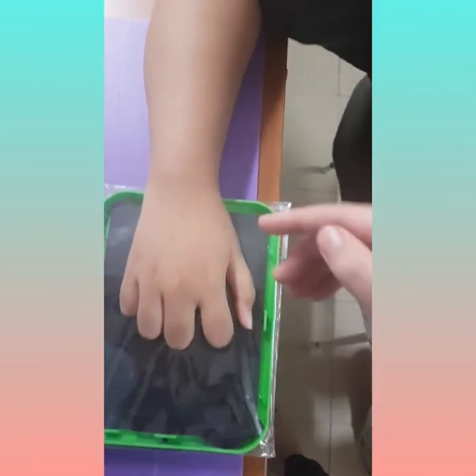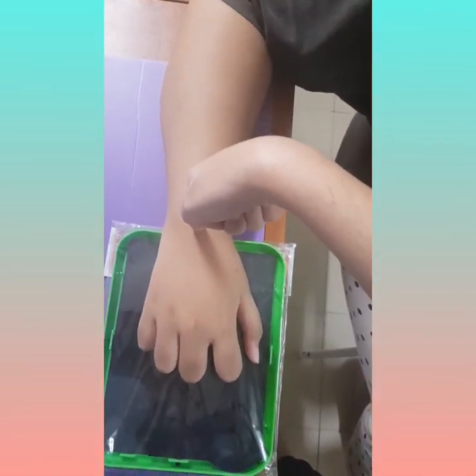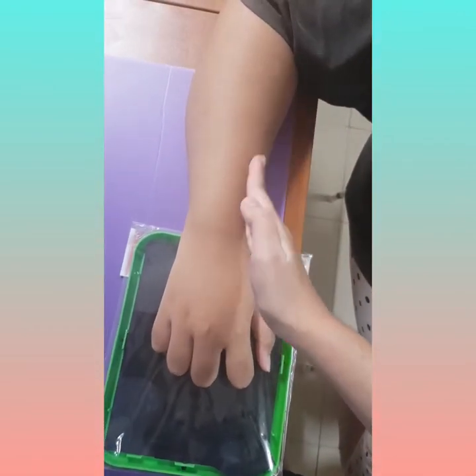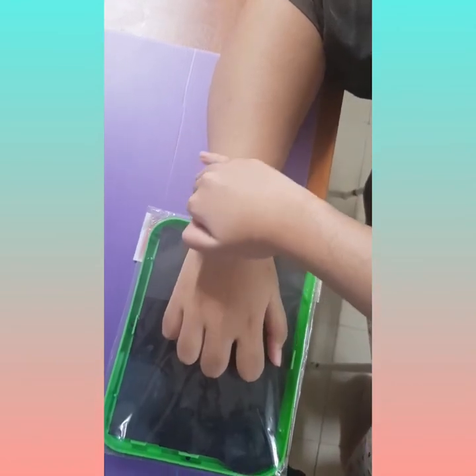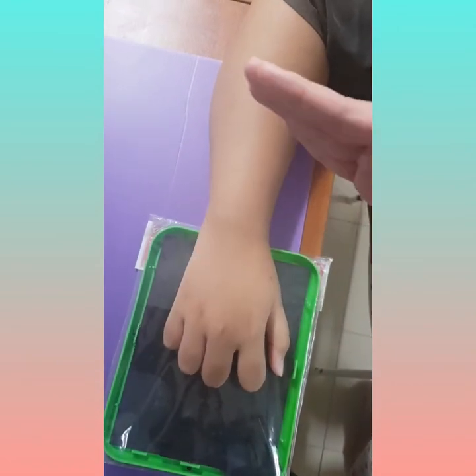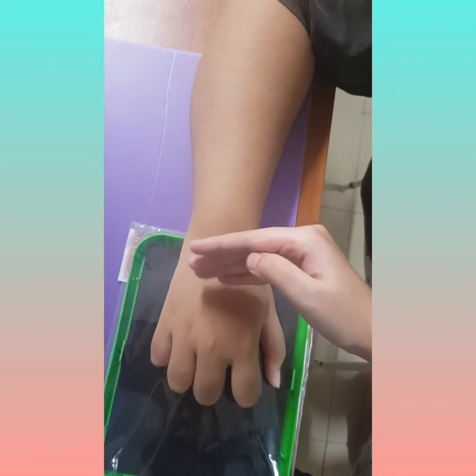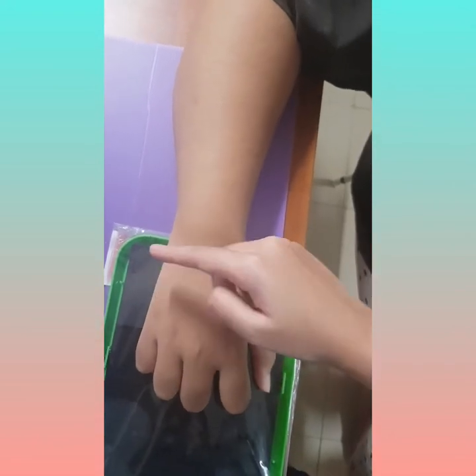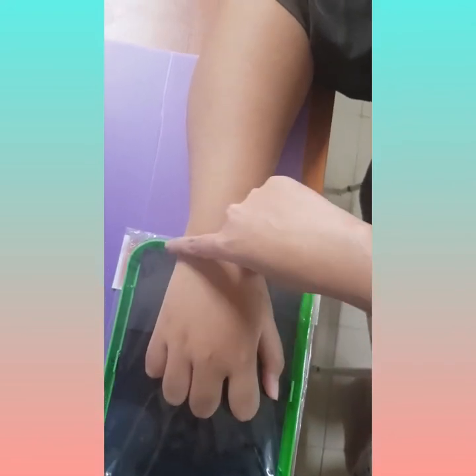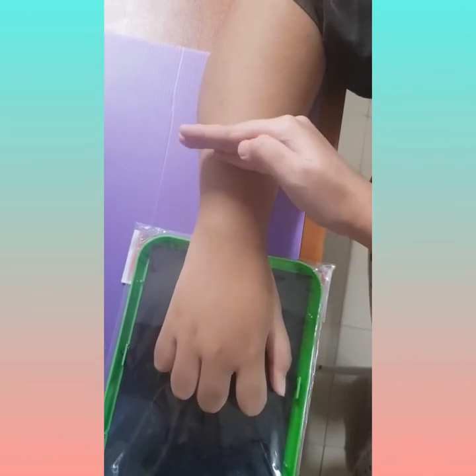With the CR at the midcarpals, the collimation should be skin to skin margin. For the top and bottom, the collimation should include the head of the metacarpals.